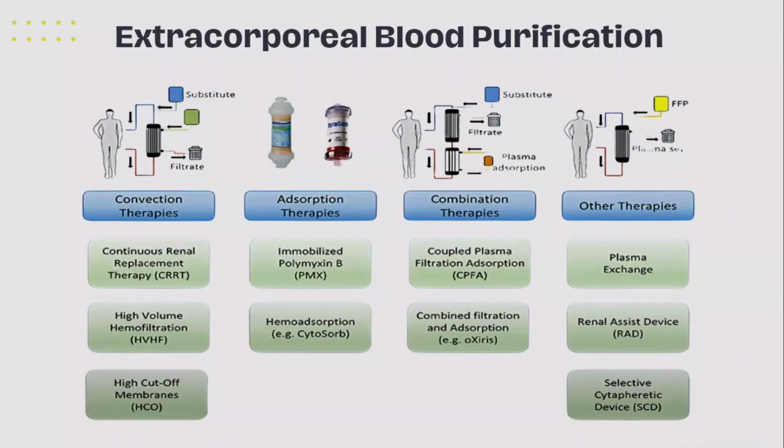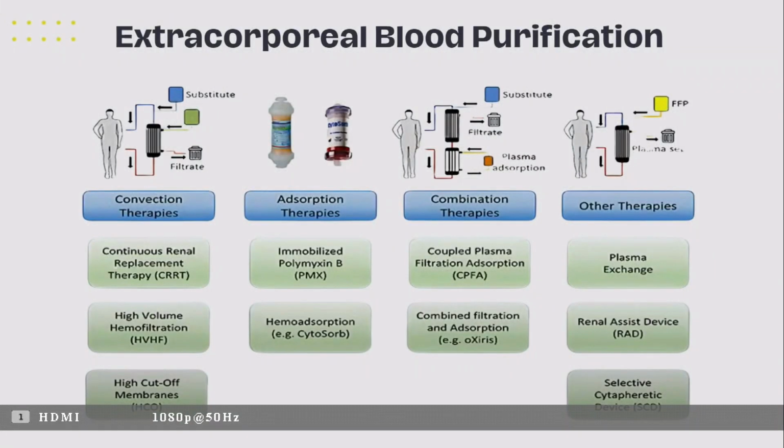And these are the options available. If you look at the plethora of these options, one thing which stands out is the adsorption therapies. It is not only a standalone therapy, it can be an add-on to the existing therapies of extracorporeal blood purification. But why do we need this hemoadsorption?